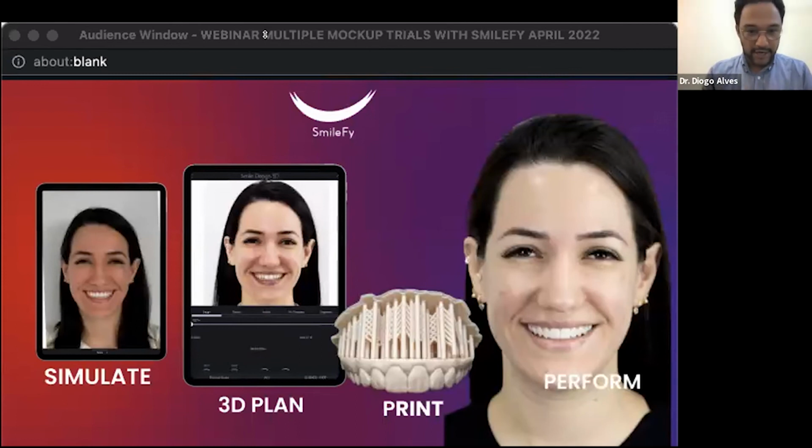Wonderful. I'm seeing here that 64% of you are like, yes, absolutely. 7% are yes, sign me up. 29% are yes, I want to know more about it.